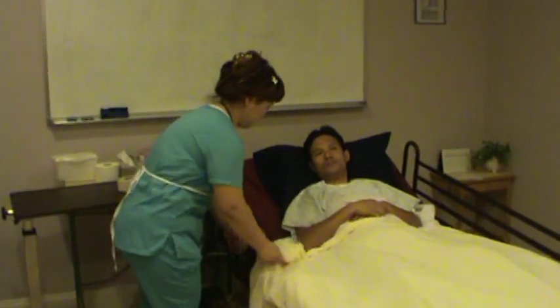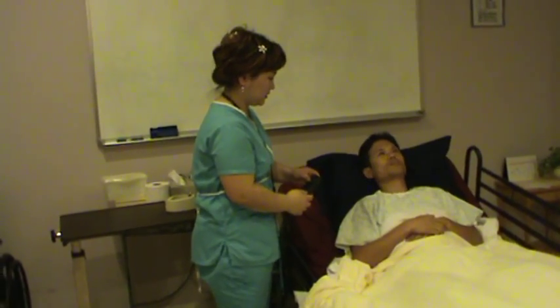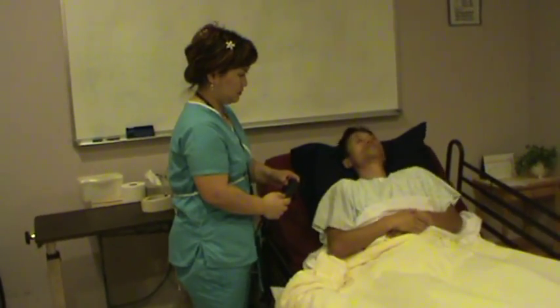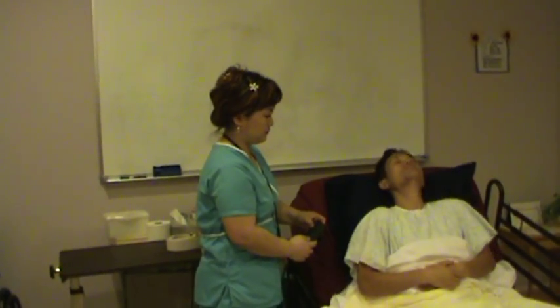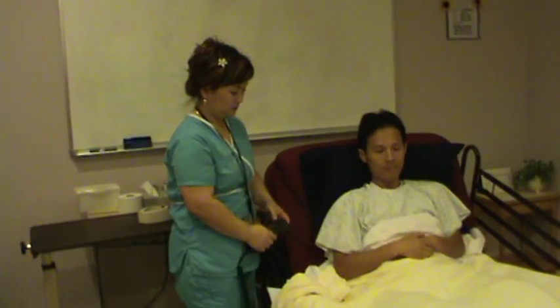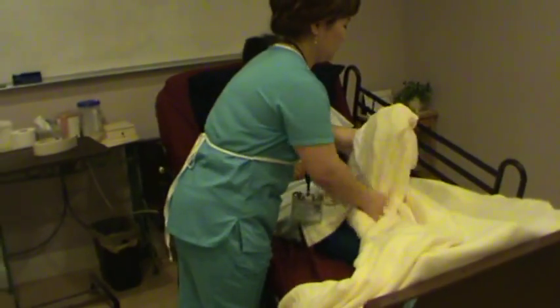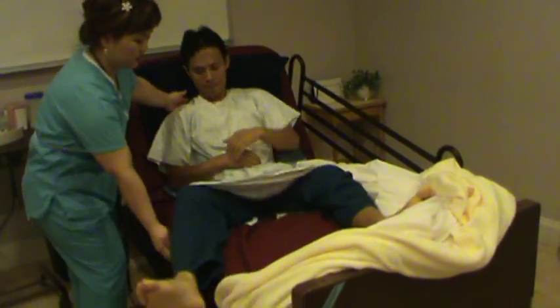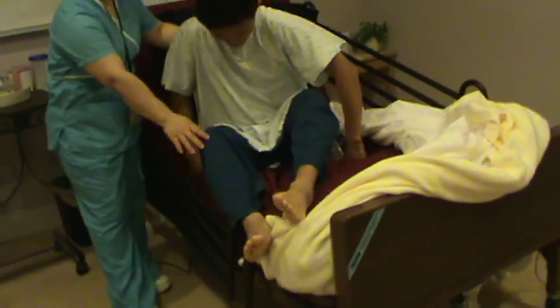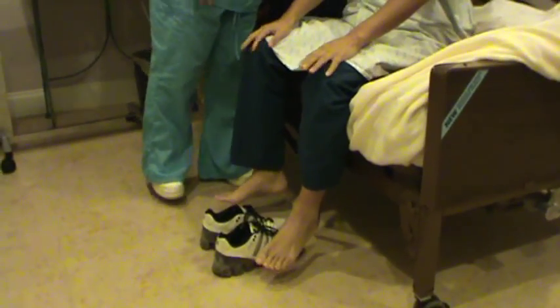Okay, Mr. Smith. I'll adjust the bed so you can stand from the bed more easily. Let's remove the blanket. I'll sit you up on this side. There you go. Very good.